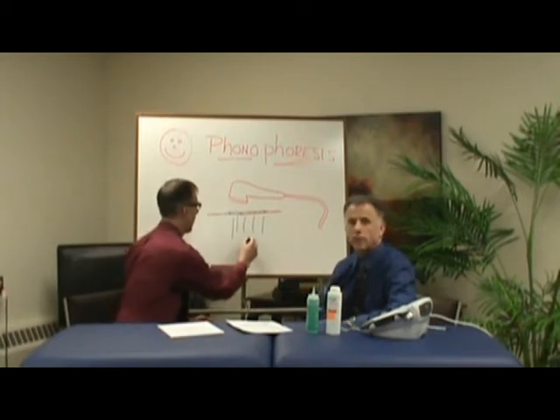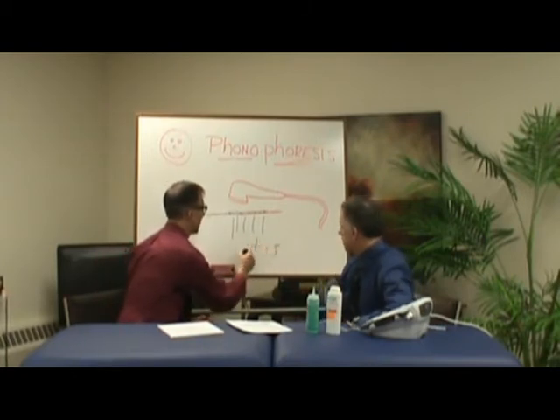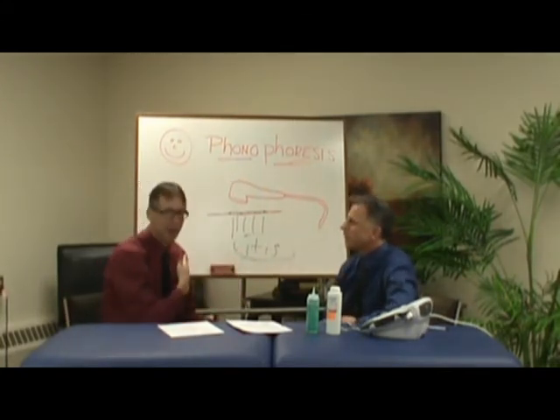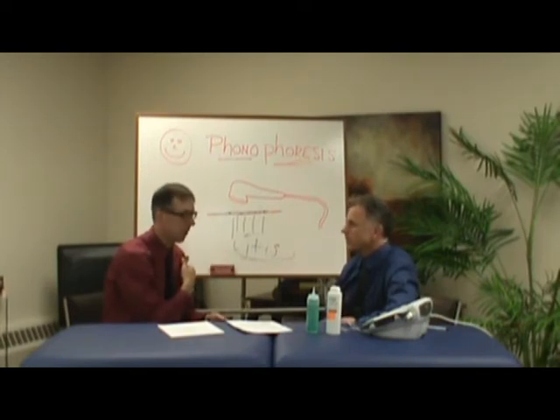All right, we're going to use the phonophoresis on the shoulder. What we like to do, again, phonophoresis works really well with any type of inflammation, so we like to call it the itises. Itis, Latin for inflammation. Is it Latin? I'm pretty sure it's Latin. I looked that up when I was in school. So what type of things? Arthritis, bursitis, and tendonitis. Right? Really, it doesn't matter if we don't know which one it is for sure, because the phonophoresis should help calm it down.